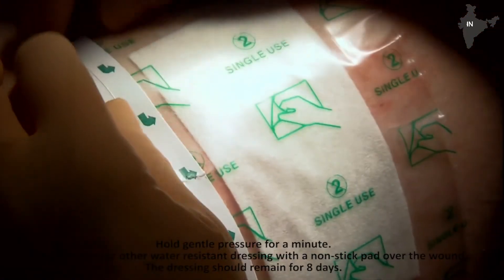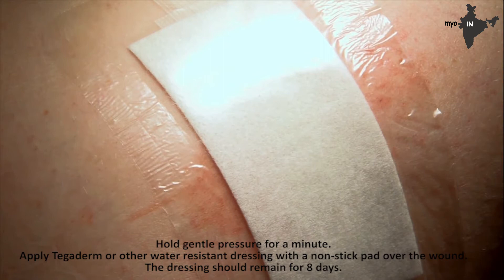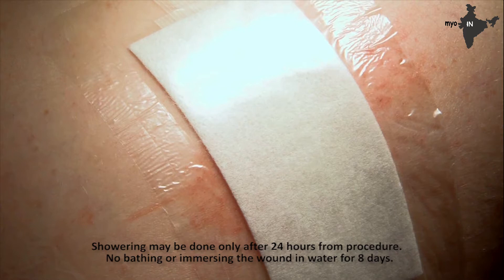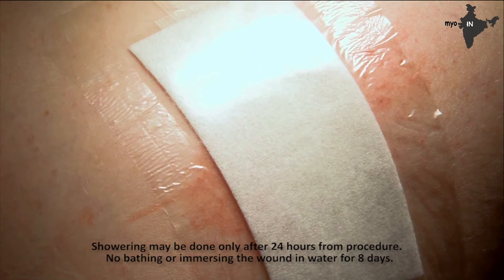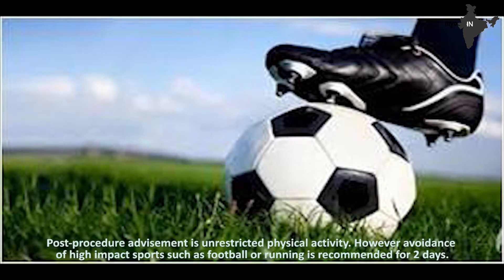After enough passes have occurred to collect an adequate specimen volume, blot and clean the area with gentle pressure for hemostasis and oppose the skin edges while the assistant applies steri-strips. Hold gentle pressure for a minute. Apply Tegaderm or other water-resistant dressing with a non-stick pad over the wound. The dressing should remain for 8 days. Showering may be done only after 24 hours from the procedure. No bathing or immersing the wound in water for 8 days. Post-procedure advisement is unrestricted physical activity; however, avoidance of high-impact sports such as football or running is recommended for 2 days.